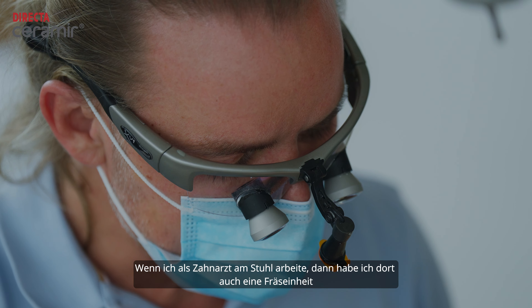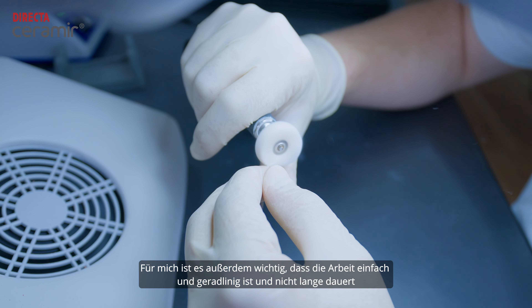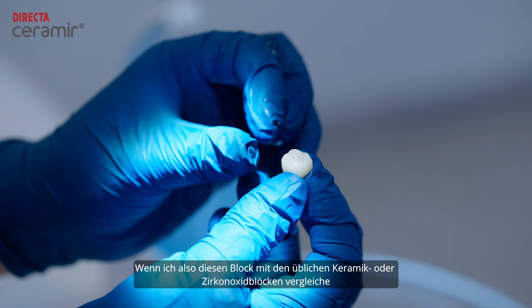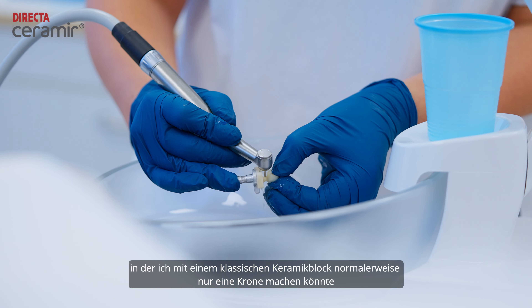If I'm a dentist who is working chair-side, which means I have a chair-side milling unit, then for me it's important to have it done very simple, very straightforward and in a minimum time period. So when I compare this block to the common ceramic or zirconia blocks, I can do three to four crowns in the same time where I normally could only do one crown with a classical ceramic block.